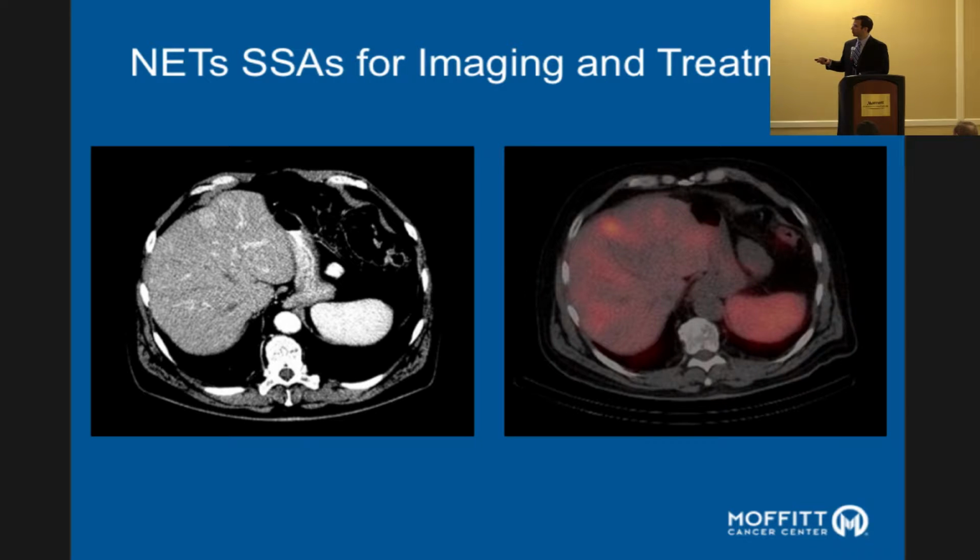And that can be why we have trouble. Even with modern medical imaging that can pick up things a couple millimeters in size, and this incredible imaging we can do with CT and MR, you can still miss tumors with neuroendocrine tumors. And you see the advantage of the octreoscan. Now you can see some normal background activity, and you just have to be aware of where the background activity is. Then you can see this is abnormal. There's background activity in the liver, but this is too much, and it corresponds with this lesion. And it's helpful because if the CT scan had some of those limitations we talked about, you'd still be able to find the metastasis, and then you would also know, is it expressing the somatostatin receptors?